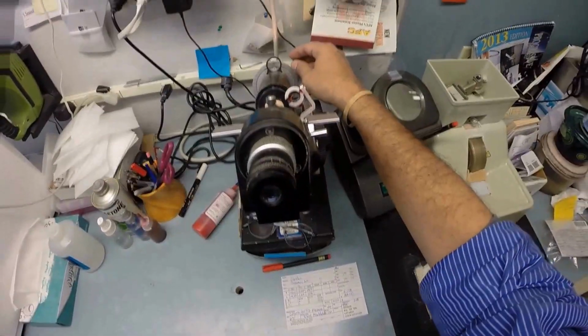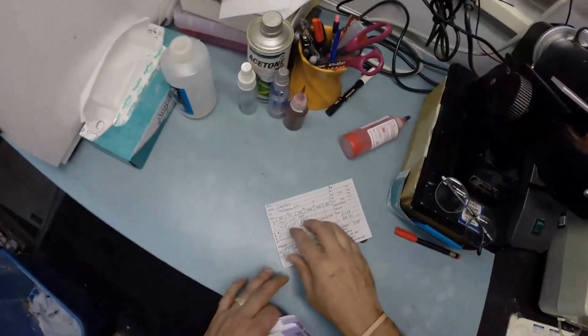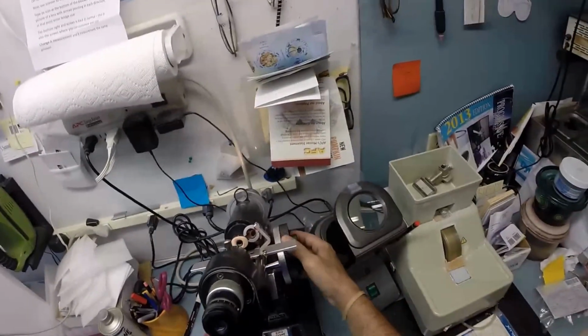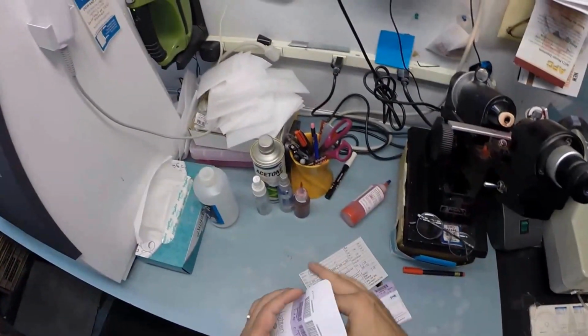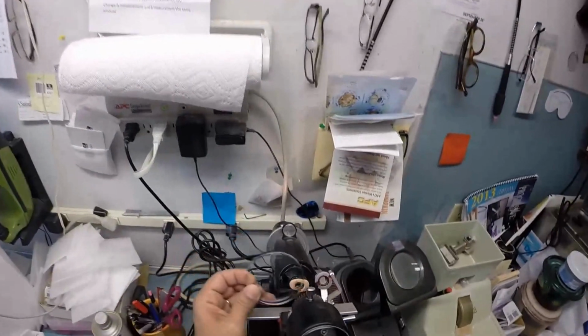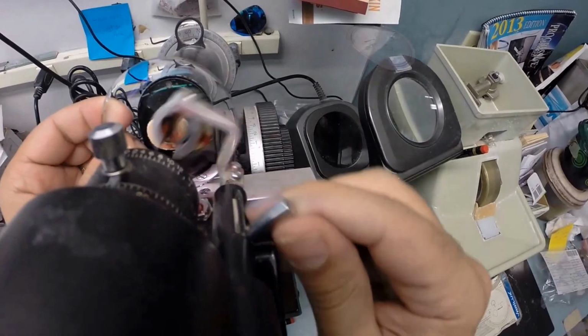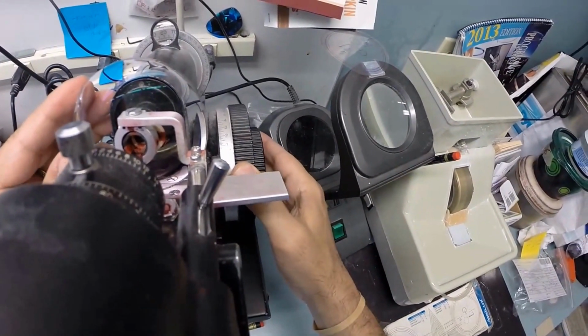I'm going to come down here to my Marco 101 lensometer, spin the axis wheel to 65. Now your prescription reads -4, -1 at 65. I'm going to put the power drum, make sure everything is zeroed out. Put the power drum on -4. Take your lens out of the protective sleeve. Put it in, rotate your lens until the sphere power comes in clearly. Find the optical center. Check your astigmatism correction.